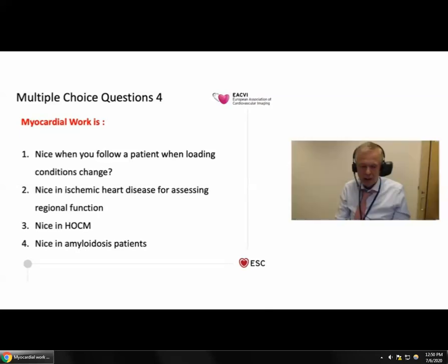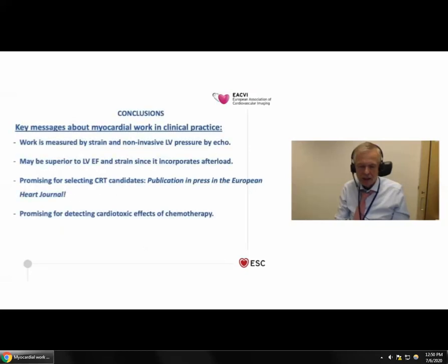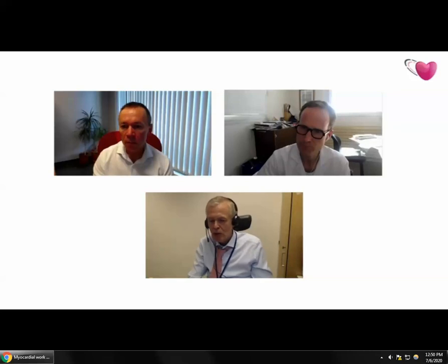Okay, well, thank you, Ervan, for a very insightful, nice lecture. Now we are moving to some questions we have received from the U.S. audience, and let me start with one. The question is, which of the myocardial work parameters is the most important? Maybe one of you would like to answer?